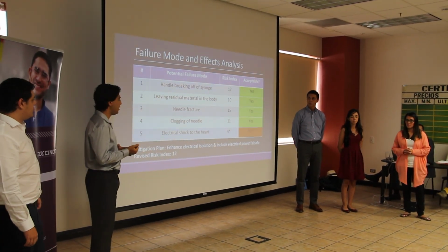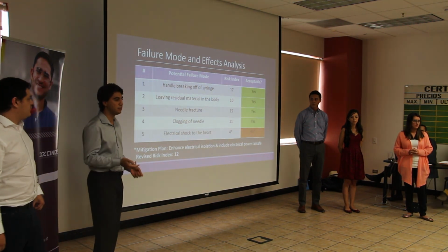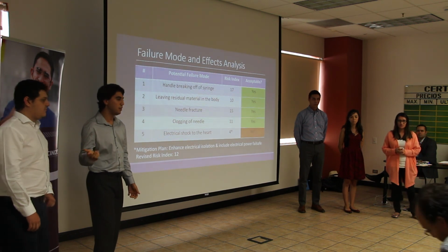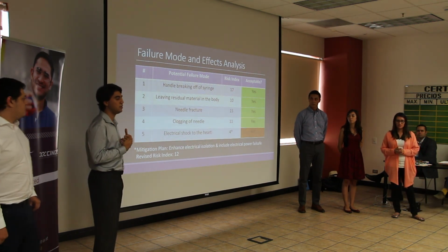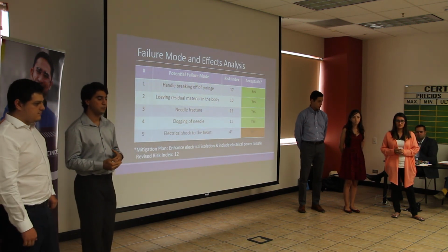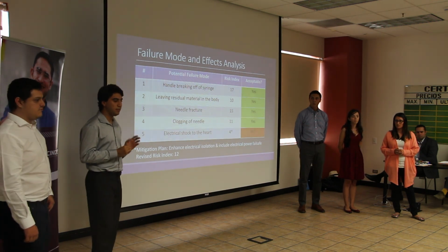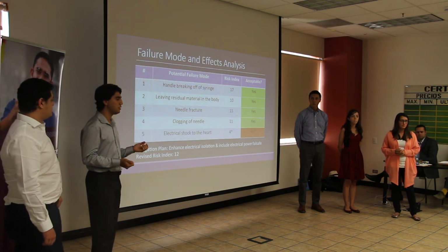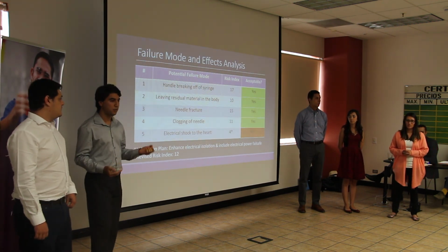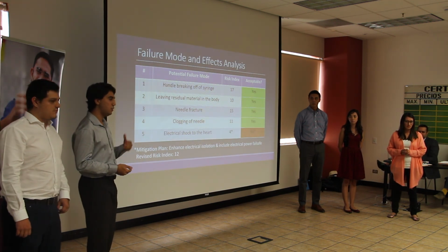For example, the needle could break, or because it's made of all these materials, photoresistors, some of them could just peel off and be left inside the body, and we would lose control of them, and they could reach the heart or other organs and be very harmful for the patient. So the severity will be very high, but we believe that if we design all the processes correctly and really control them all the way through, like with good welding processes, you can make the occurrence of those things almost improbable.